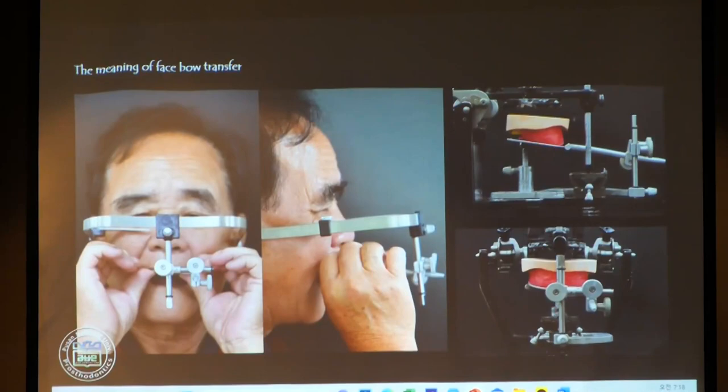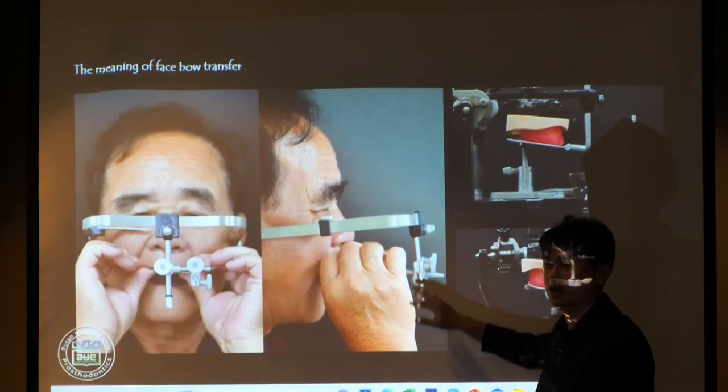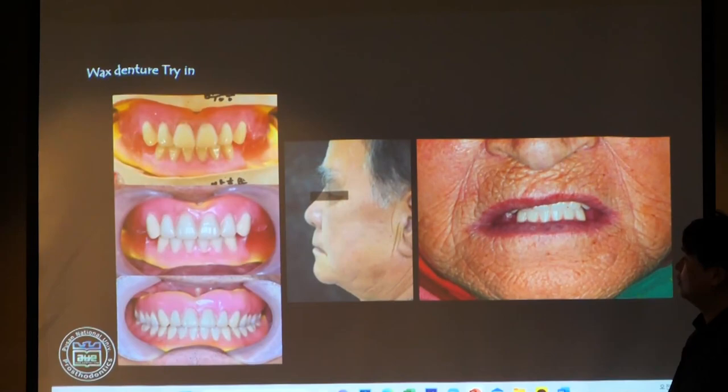And then in school, we were taught about the use of a facebow transfer. Whenever I teach this method, I'm so sorry to my students. Anyway, and then we can get the wax denture like this, okay?